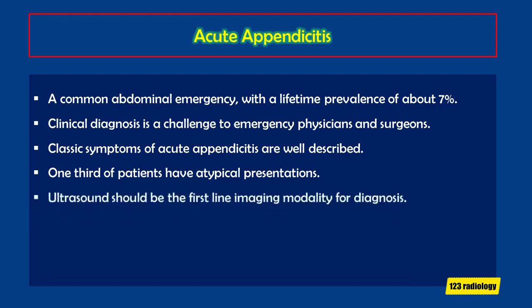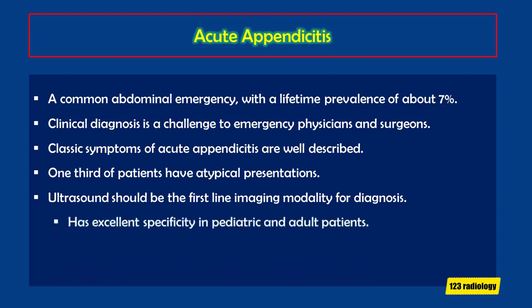Ultrasound should be the first-line imaging modality for diagnosis of acute appendicitis, as it has excellent specificity, both in pediatric and adult patients.